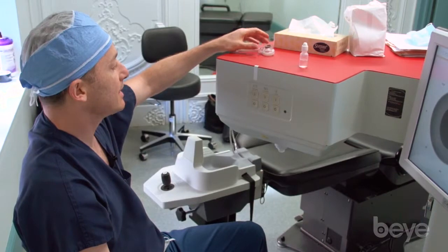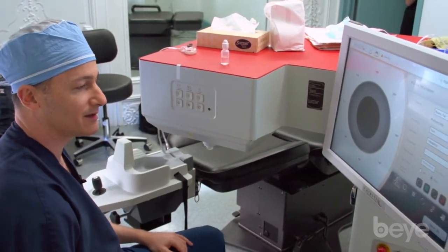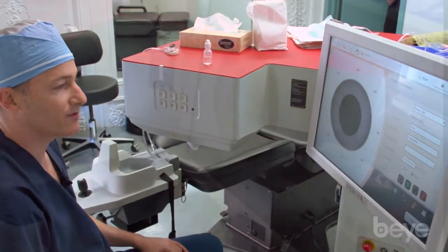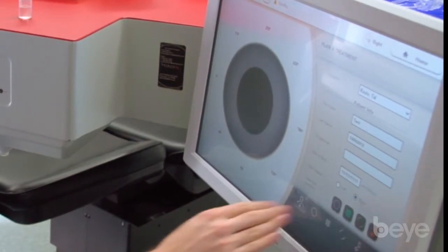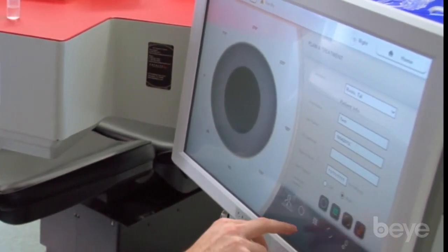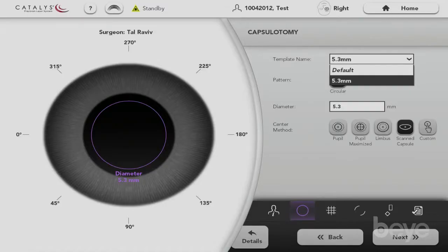The user interface is really nice and simple. Everything is done on a large touchscreen, which we're all accustomed to in the iPad generation. We have programmed the four different cuts the laser can provide: the capsulotomy, fragmentation of the lens, arcuate incisions, and corneal entry incisions. You can choose all four, all three, or however many you'd like. There are default templates — for example, my 5.3 millimeter default is easy to select.